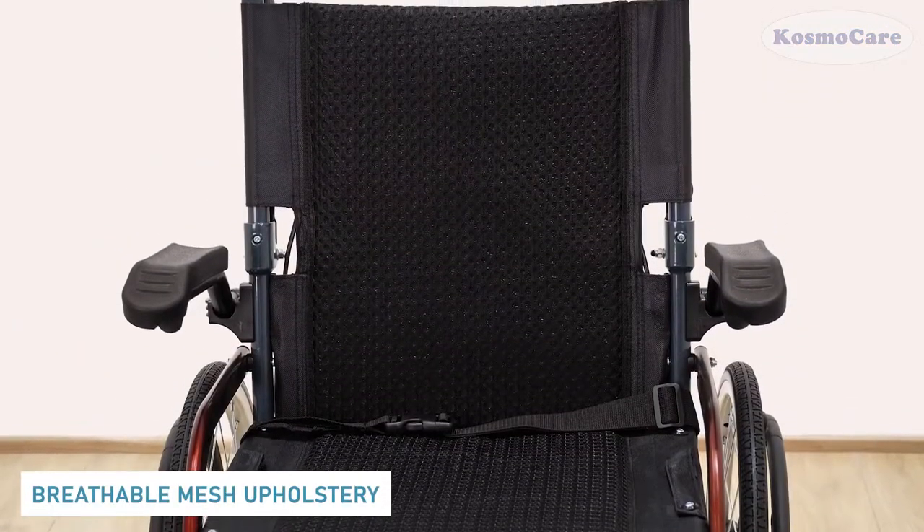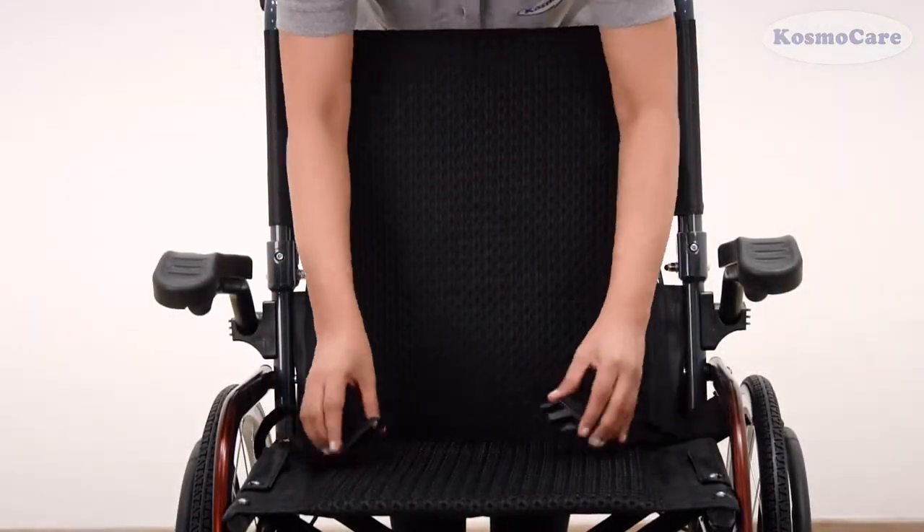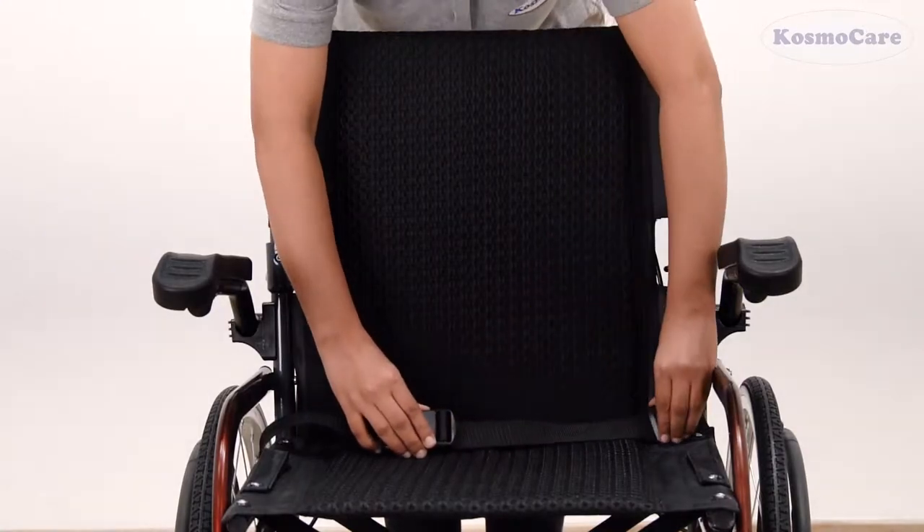The seat is upholstered in a comfortable mesh fabric that is water-resistant and also breathable, and the built-in seat belt enhances user safety.